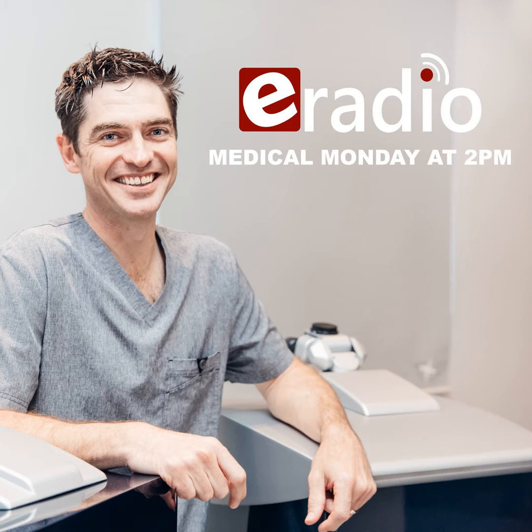So about 30 years ago, the first laser vision correction procedure was performed in the United States. That was called a PRK, or photorefractive keratectomy. LASIK wasn't available yet. LASIK is where, as I've said earlier, we create a flap, we lift the flap, we laser, we put the flap back down. The beauty of LASIK is that it's a very quick visual recovery, with exceptionally minimal discomfort. Maybe for the first 2 or 3 hours you can have a feeling of sand or grit in your eyes, and the visual recovery is exceptionally fast. A lot of my patients who come down for LASIK, if they've driven a certain distance, the day after surgery, if they're seeing well enough, they drive themselves home.